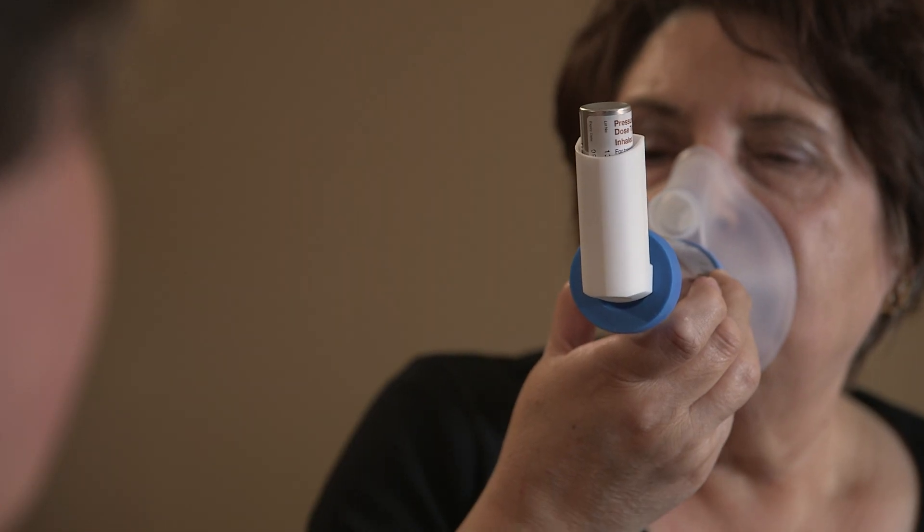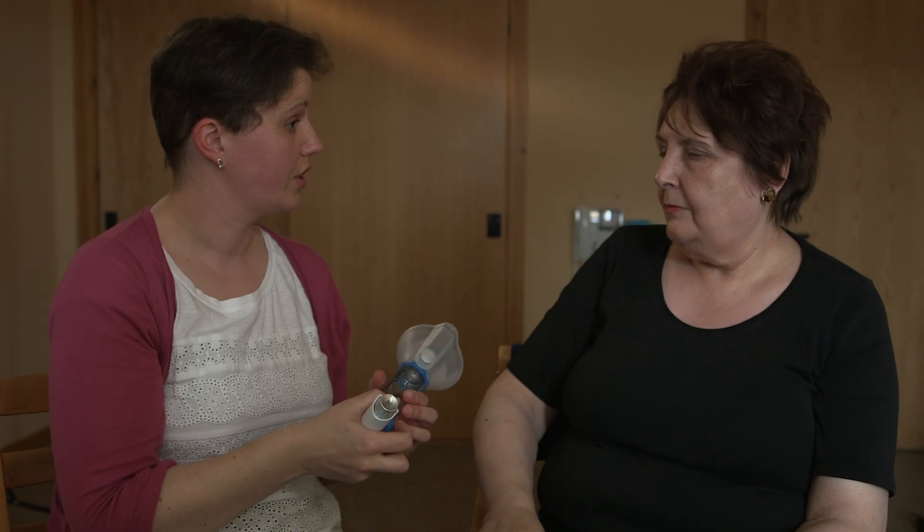One, two, three, four, five. I'll take that away. Now we'll just leave you 30 seconds and then give you a second puff.